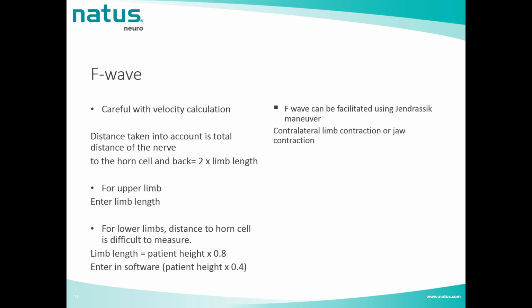In some cases, when the F wave is difficult to record, there is a small trick we can use to facilitate the recording, which is called the Jendrassik maneuver.